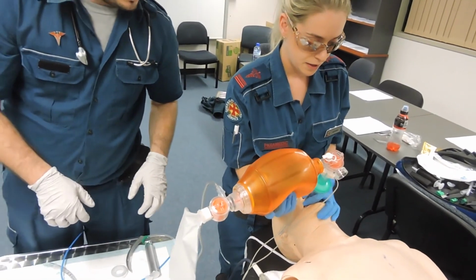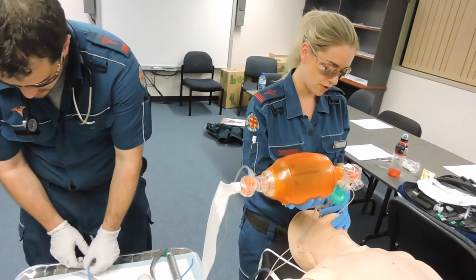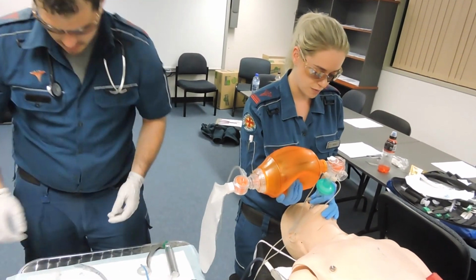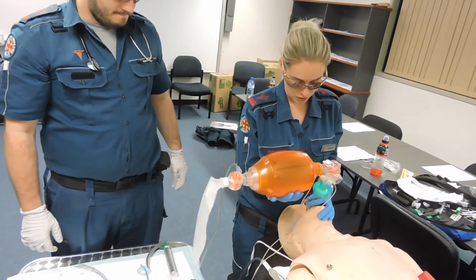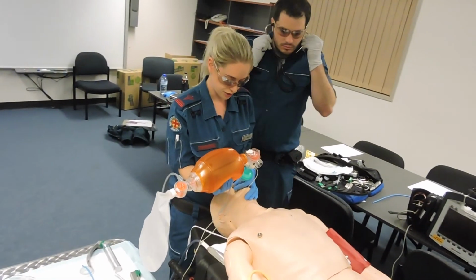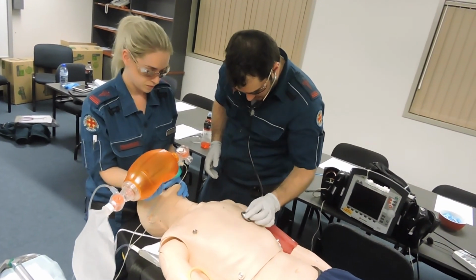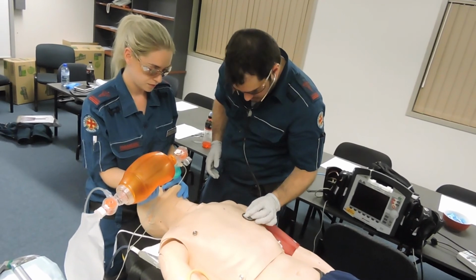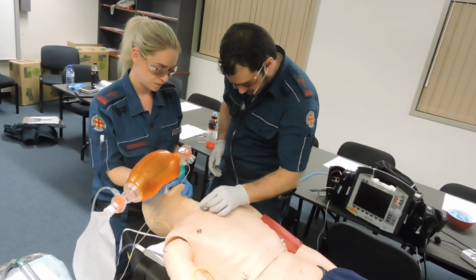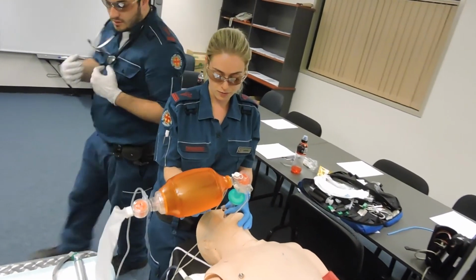Alright. So with the LMA I'm looking for rise and fall of the chest, looking for fogging of the tube, which I've got, and condensation in the tube. I would get my partner to auscultate for me, and I'm also looking at my CO2 and my SpO2. Equal. Brilliant. Alright Ben, thank you very much for assisting me.